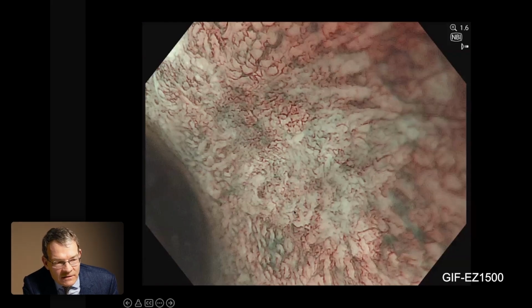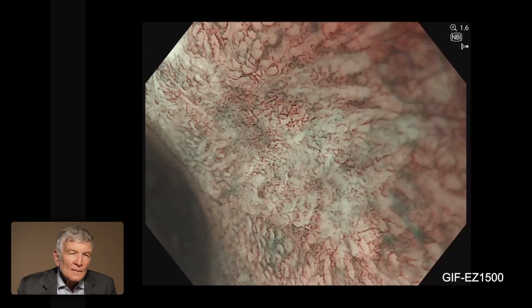There's no connection, there's no mucosal structure anymore. So I think this is a nice example of a small early Barrett's cancer lesion. No, absolutely. But honestly, the high-grade dysplasia looked worse before, right? Exactly, yes. Okay, very good.